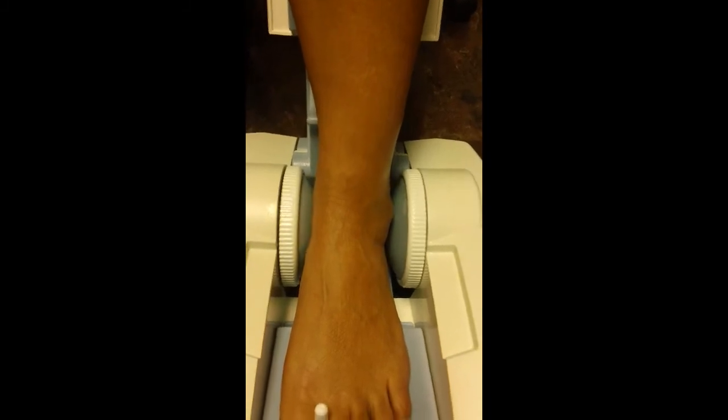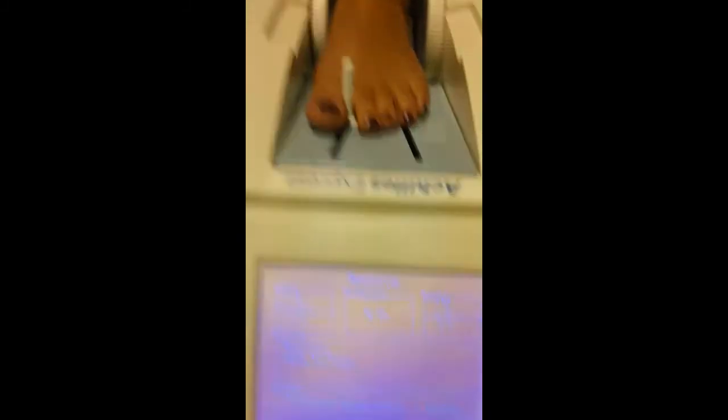She can put her boot back on. So that was it — that was the entire process.